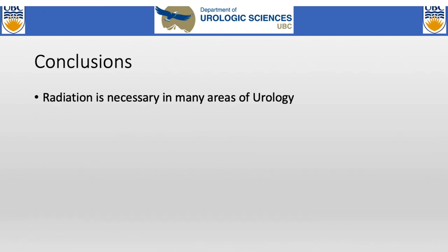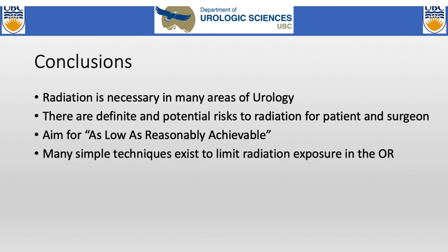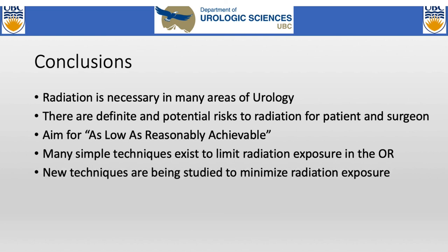So in conclusion, radiation is necessary in many areas of urology. There are definite potential risks, both for patients as well as for us as urologists. The goal is as low as reasonably achievable. There are lots of simple ways that you can reduce radiation exposure in the OR, and lots of new techniques coming out also targeted to reducing radiation risk.